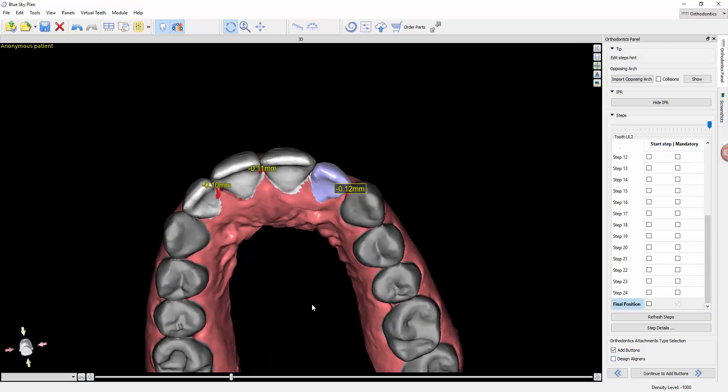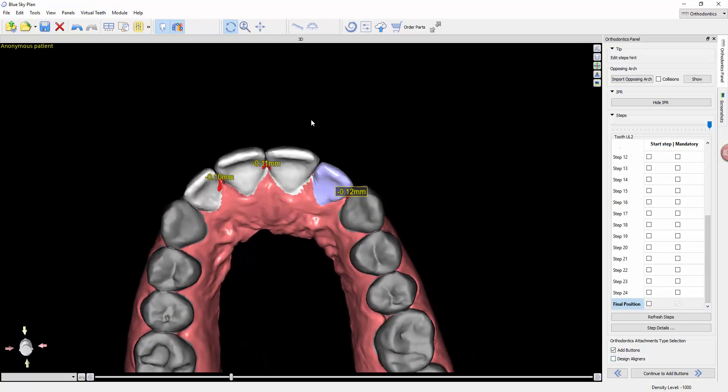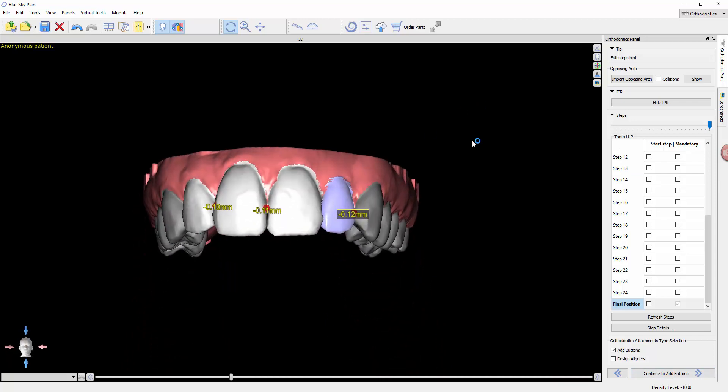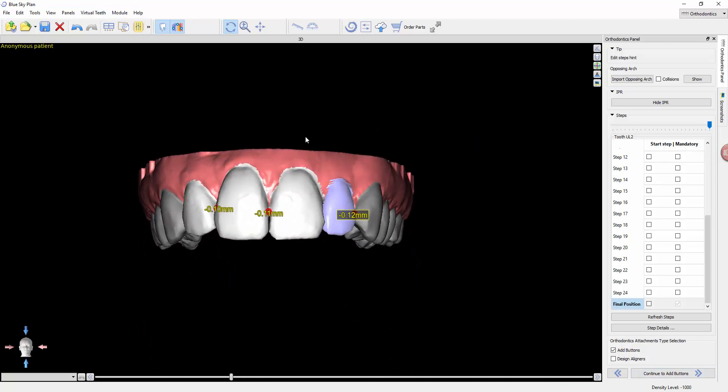So for now, so long as we agree with the alignment, we will progress from here to the next stage, which is to add buttons. But before we do that, we want to evaluate which teeth most likely need buttons.